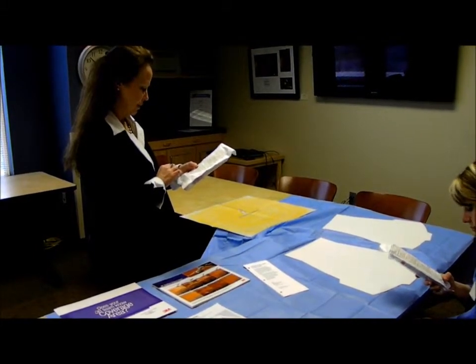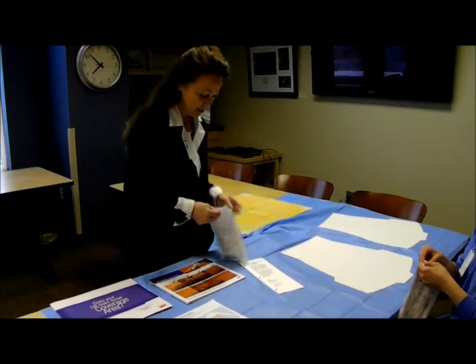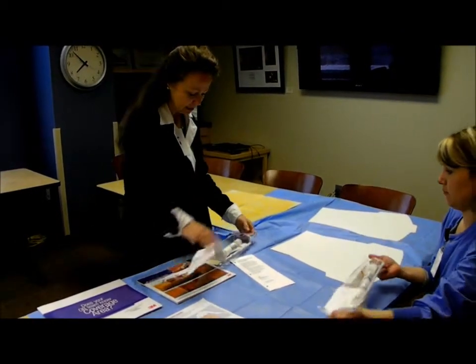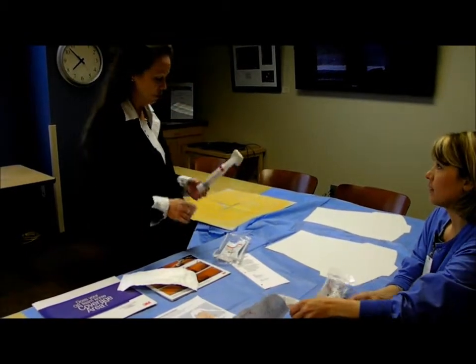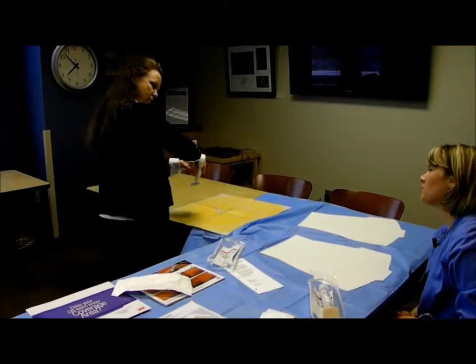That's pretty much it. So let's go ahead and prep. To open, just open it up like this. And if you do not use gloves at all, you want to be sure when you go to prep the patient that you're holding it here as opposed to here. I think that was a question of the staff.